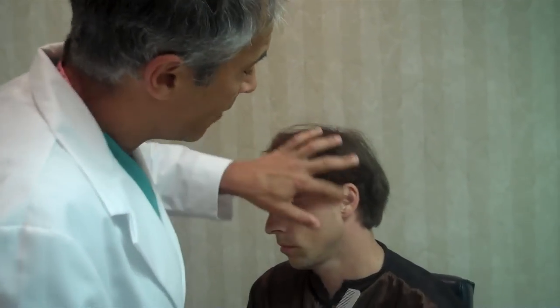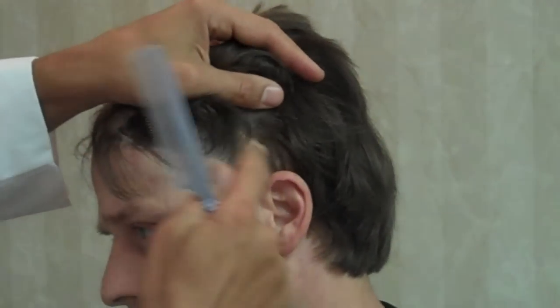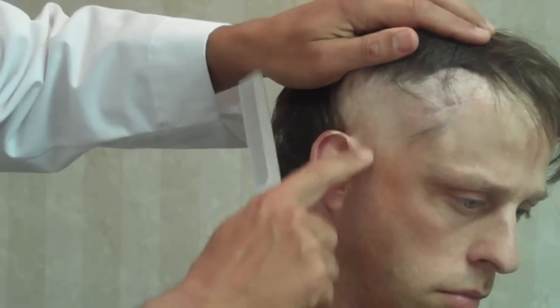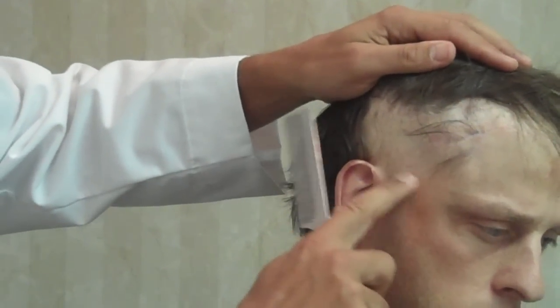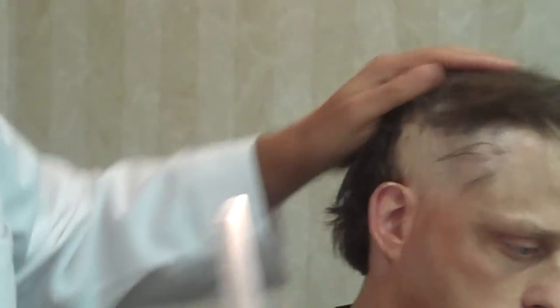Today, in addition to putting the balloon expanders in, we're going to do some hair grafting along here into this scar and up into this area, taking hair from the back. And lastly, I may do some hair grafting like right into here to start giving him a sideburn, which will make a nice difference for him, because this is good tissue.